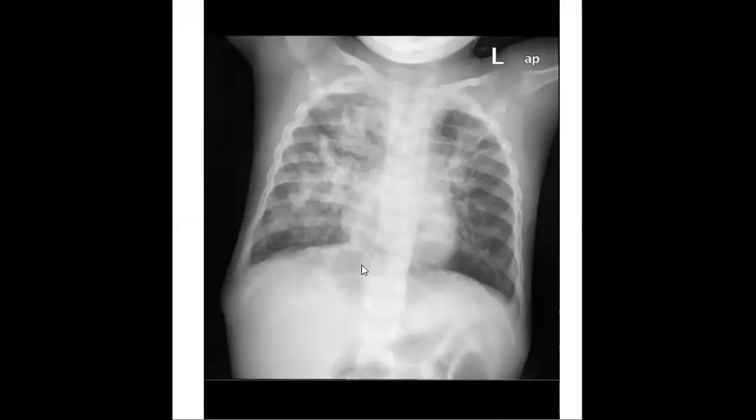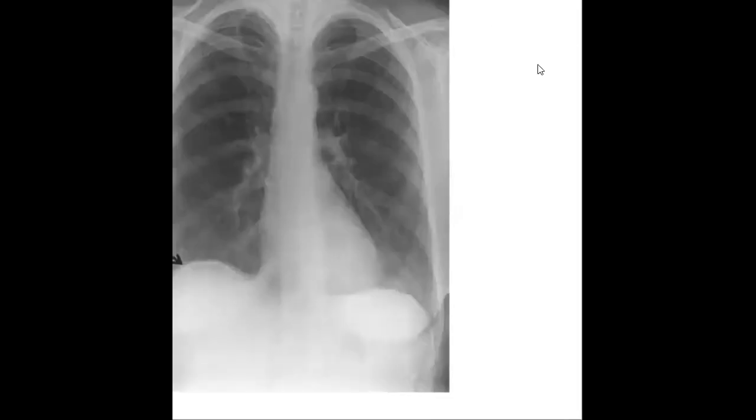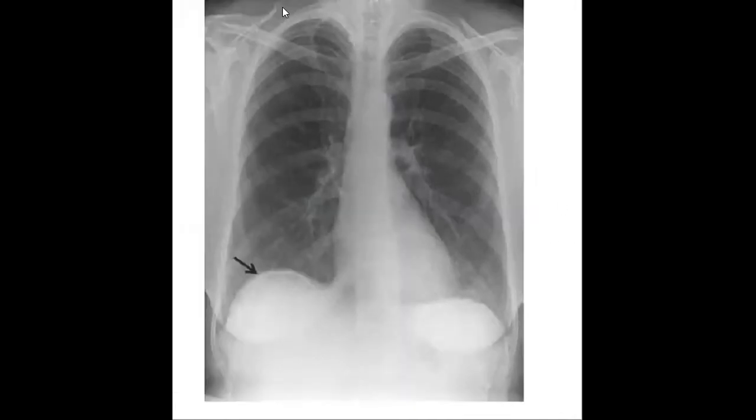Again, there is lung consolidation, bilateral. We will continue for maybe 10 minutes after it disconnects. It will disconnect in less than 1 minute. What do you think about this calcification? Let's start after a 1 minute break.